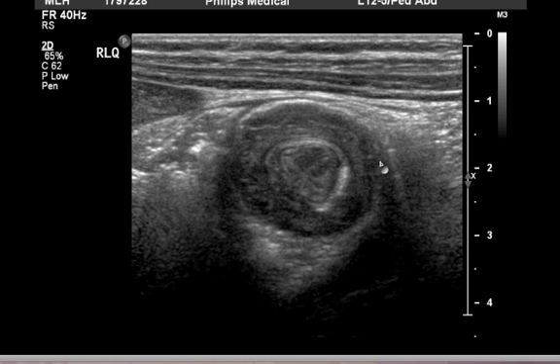And look at this — bullseye. Well, exactly. That's what this is. This is a bullseye, and this is the characteristic finding, the appearance of intussusception.